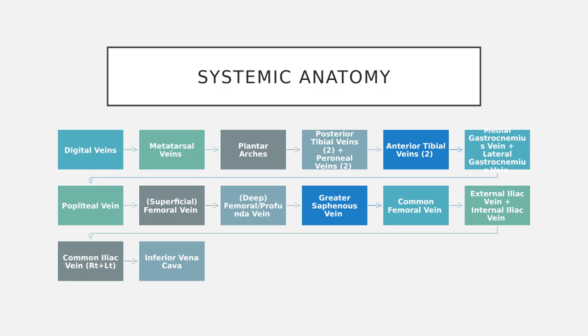As we travel up the thigh, that popliteal vein is now going to be considered our femoral vein. Now, again, varying literature on this, varying terminology depending on where you work and radiologist preference. There are some places that call the main femoral vein in our thigh the superficial femoral vein, which is confusing because it's not considered a superficial vein. It is a deep vein. So we're trying to move away from that terminology and we're trying to call it just the femoral vein, right? Because that's the main thing that we're looking at, this femoral vein that's going to run up and down our femur, right? Our thigh.